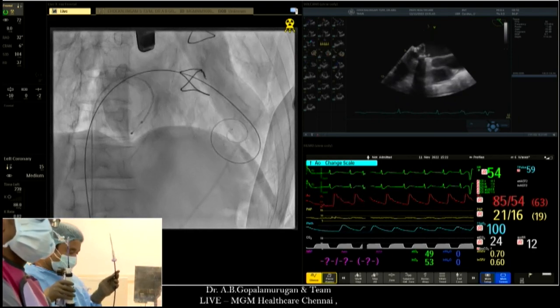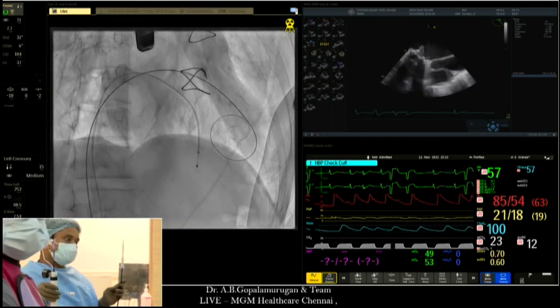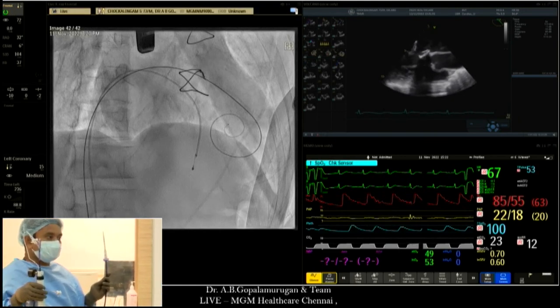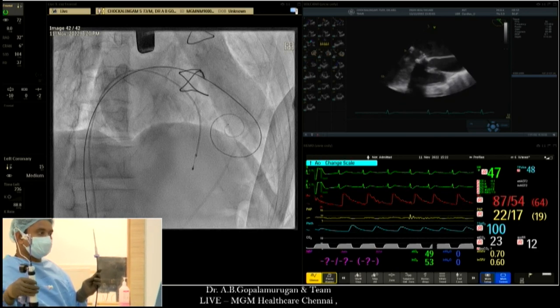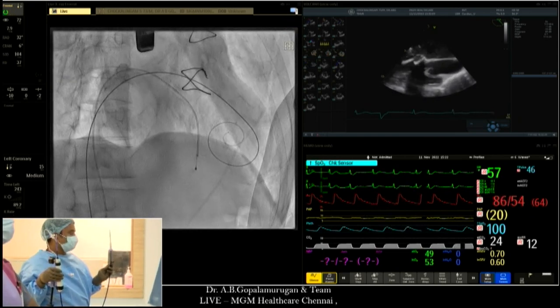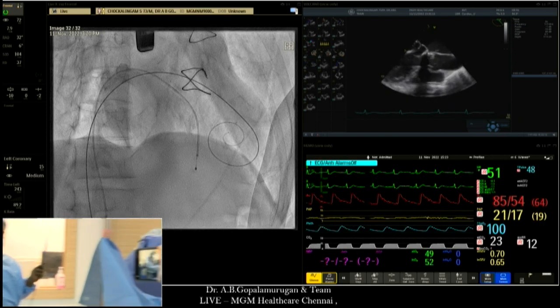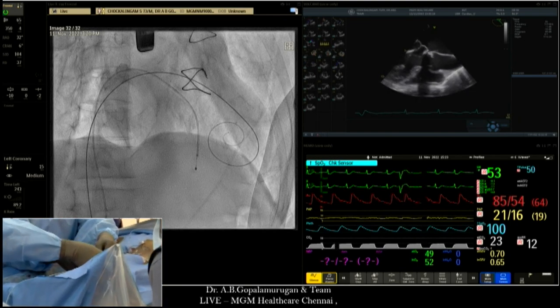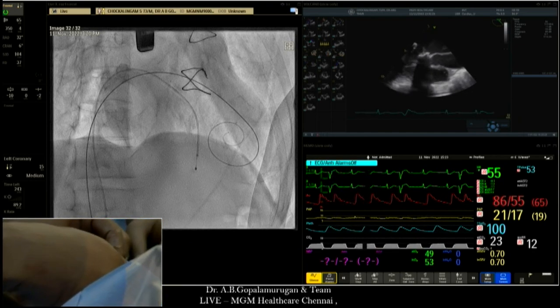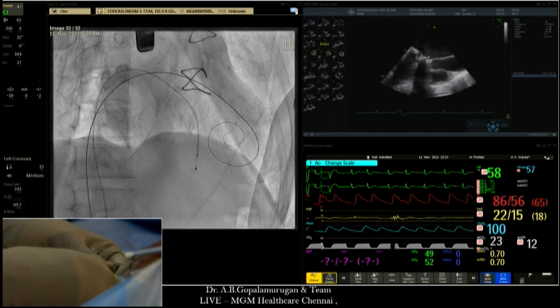So Gopal, now we are using a 26 millimeter Sapien 3 here. The access will be 16 French. So for the venous access, you prefer 16 or? Yeah. So it's going to be an e-sheath, 14, which will go up to 21 when we get the valve through. A venous access, you can see here on the camera, please. Show us the connections, please. Do you prefer ProGlide or surgical for venous access? ProGlide. We always ProGlide it, both for mitral clips and e-sheaths, and that usually closes nicely.